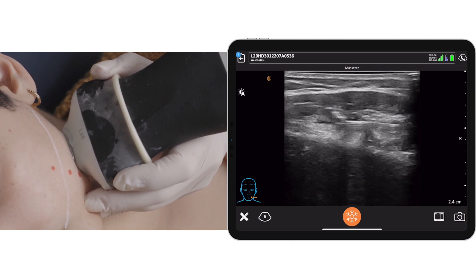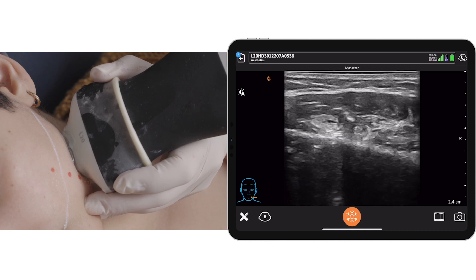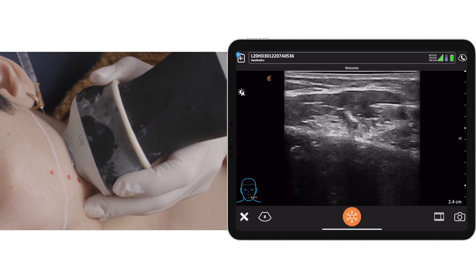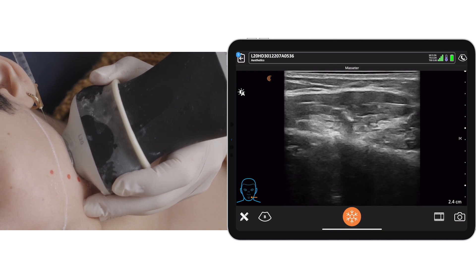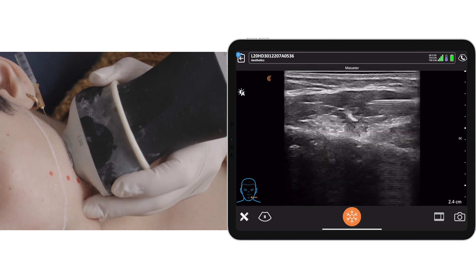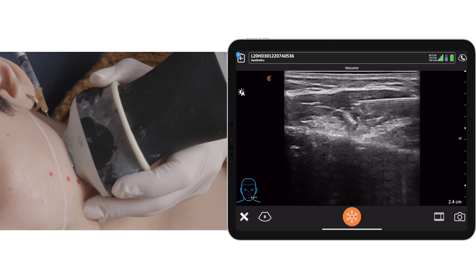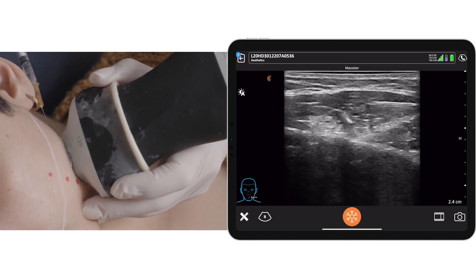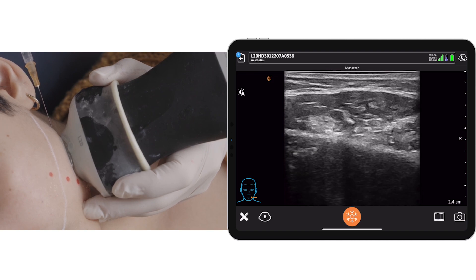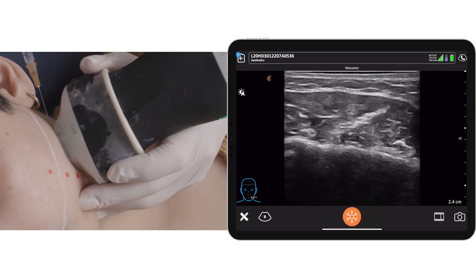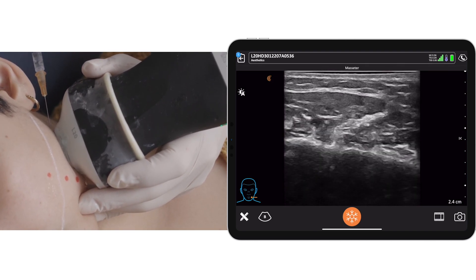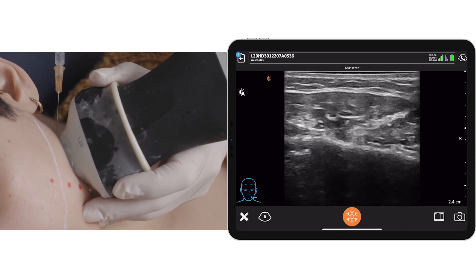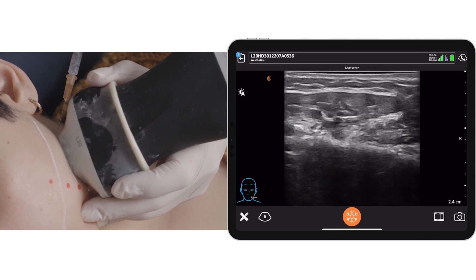I'm now going to move my needle and reposition it so that I can target the superficial head of masseter. Then I'm moving my needle again to target the deep head of masseter.